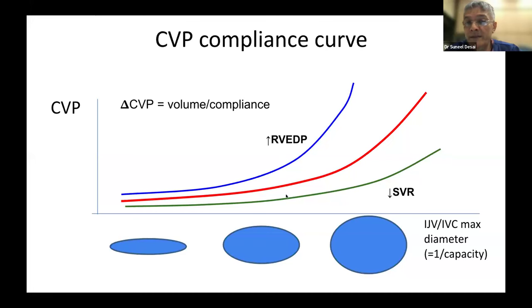And equally, when you have high venous compliance and a high capacity to take volume on the venous system, the rate of rise of CVP when you administer volume to a patient will be slower. So actually, to say that you should fill somebody to a certain number of CVP is not accurate at all. And actually, you can see that ultrasound would be the most accurate, most sensitive marker of the endpoint for filling compared to pressure-based measurements.